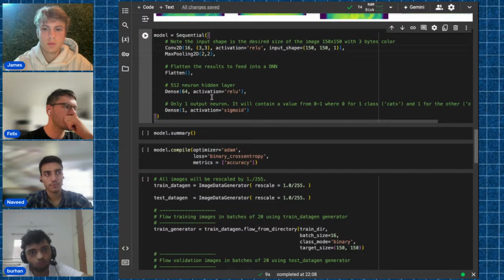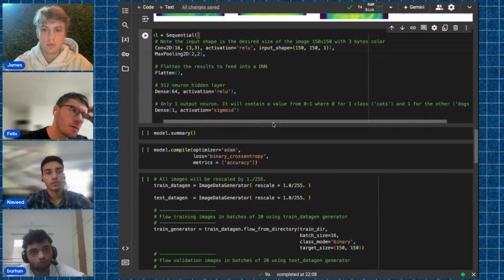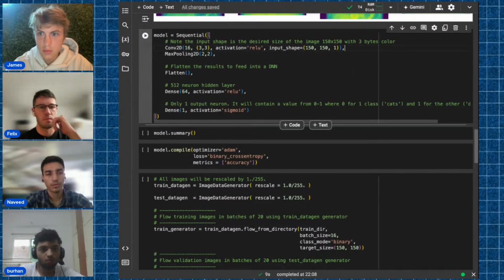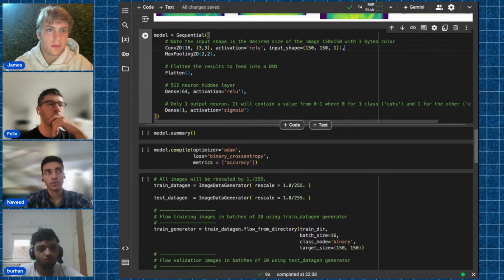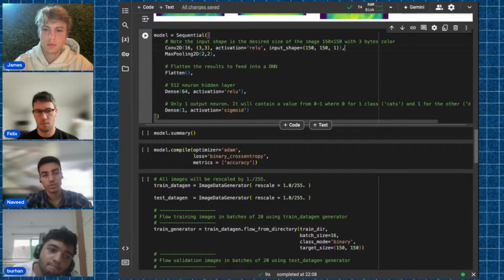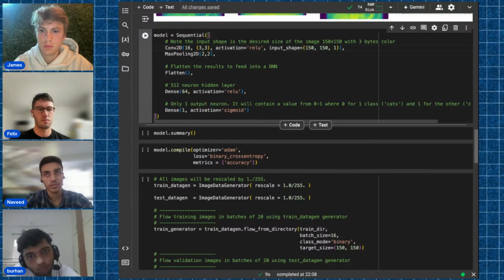Does it make sense? The last part I didn't get. Thresholds. Oh, so the model is actually going to give you a probability score, which would vary between 0 and 1. So the closer it is to 1, it just simply means the higher the model thinks that this belongs to class 1. And the closer it is to 0 means the model predicts that there's little chance that this is class 1, meaning this is the other class.